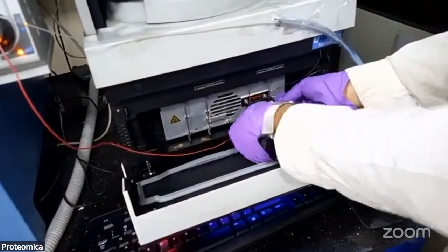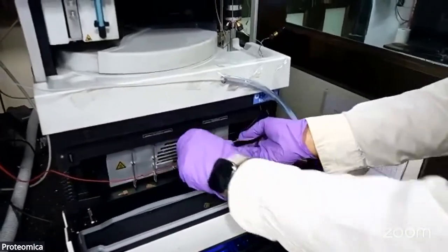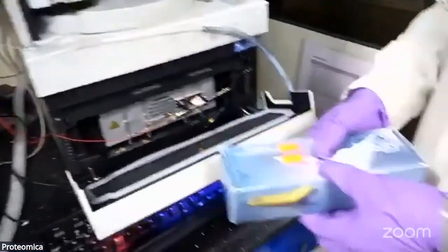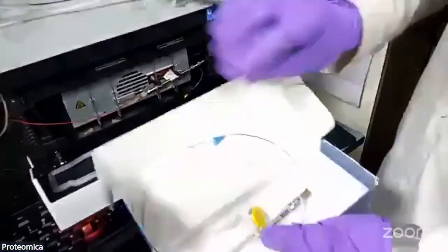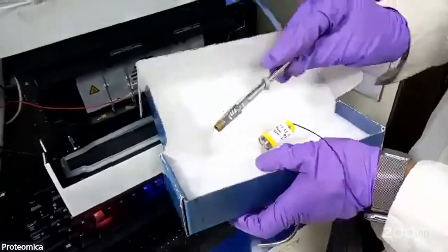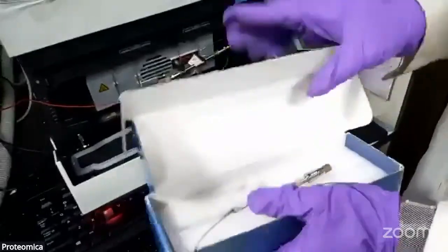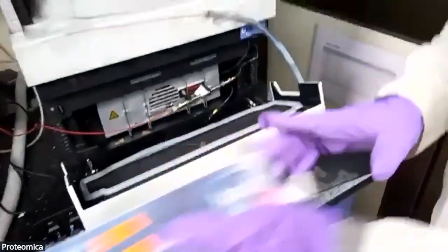This is called a Hypersil Gold column. We use this exclusively for metabolites. Sometimes you also use it for lipidomics. This is another column, called the CSH C18 column. Every column has its own chemistry and its own particle size to differentiate among those small molecules.